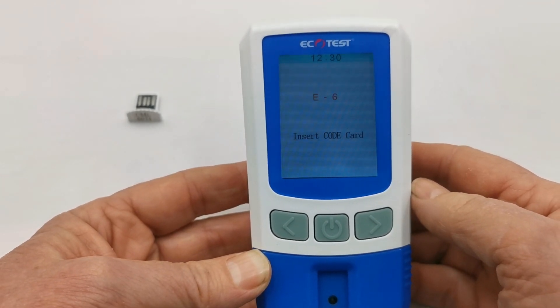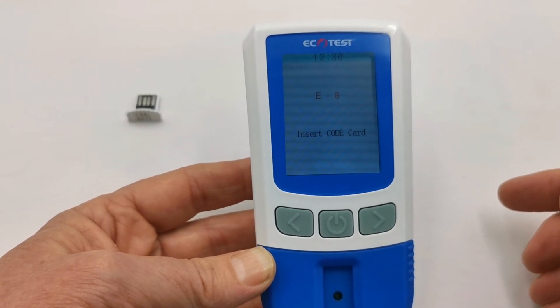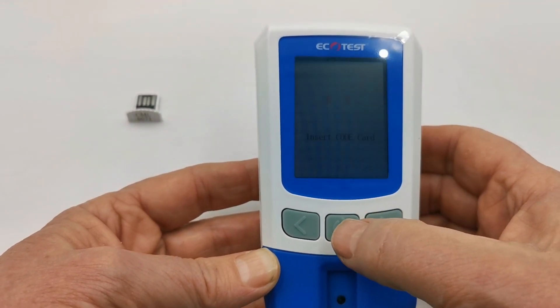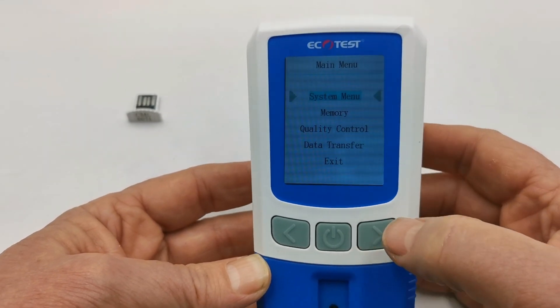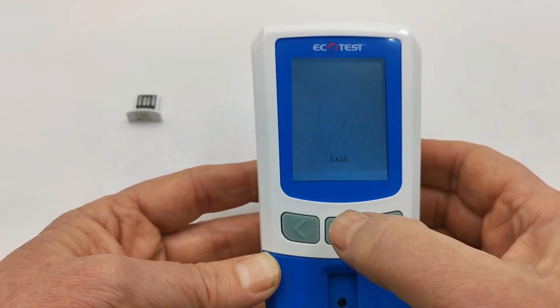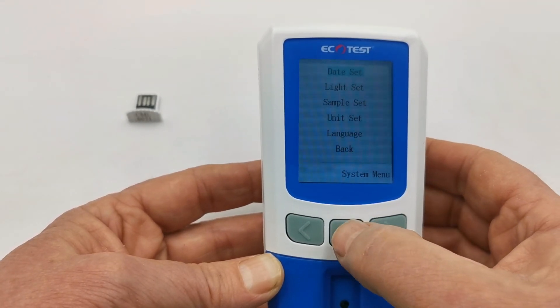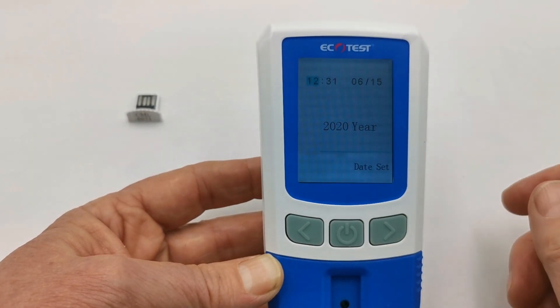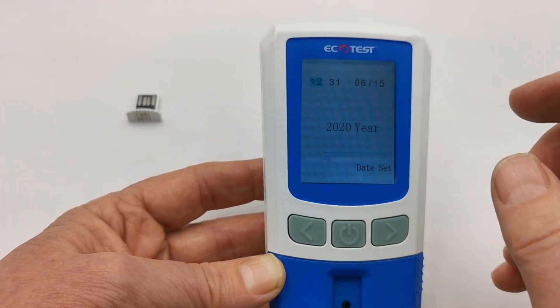To enter the time and date, the default setting is requesting the code chip being inserted, which is supplied with the test strips. You can override this by just holding the power button for two seconds and you'll see the menu comes up. Enter the system menu by depressing the power button a second time. Select the date setting by touching the power button again and you're in straight to setting the hour and minute, month, and day.